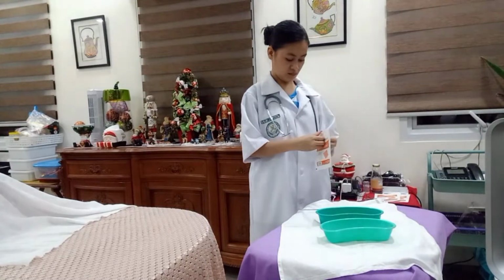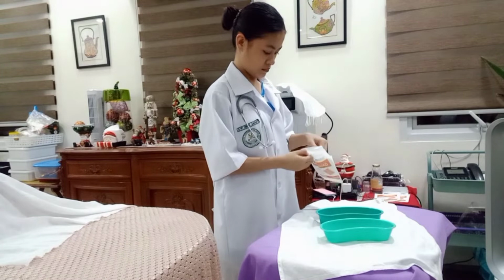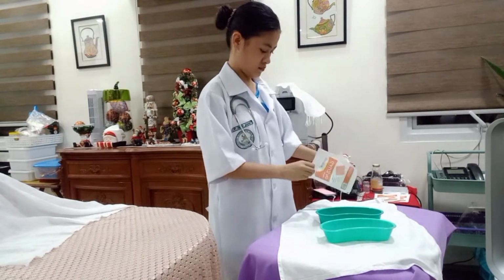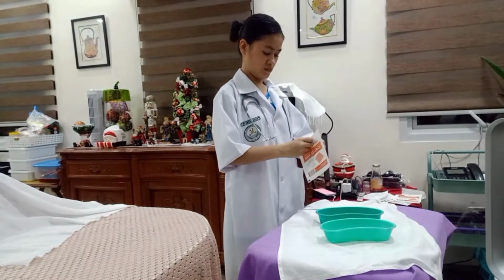For the rationale, you will use the third package of gauze to dry the skin around the tracheostomy site after cleaning. Then, prepares the applicators for cleaning the exposed surface of the outer cannula and the stoma site located under the faceplate of the tracheostomy tube, respectively.